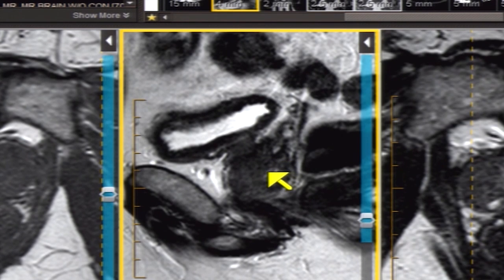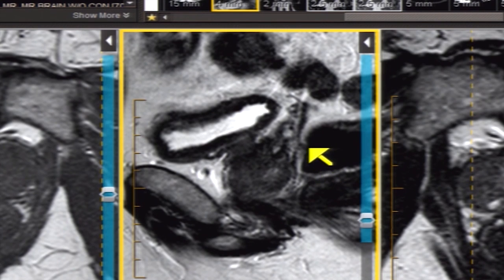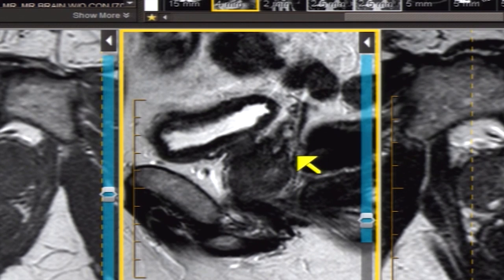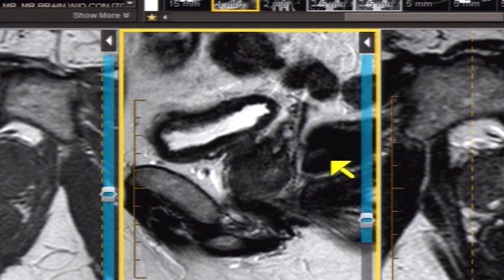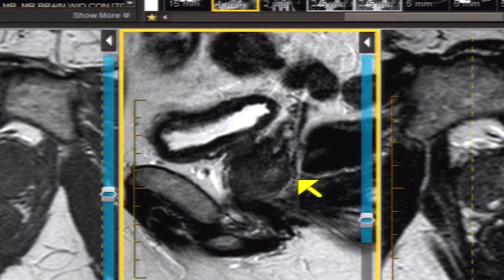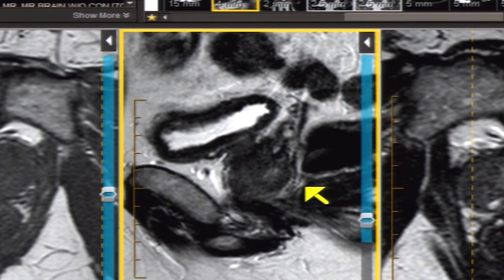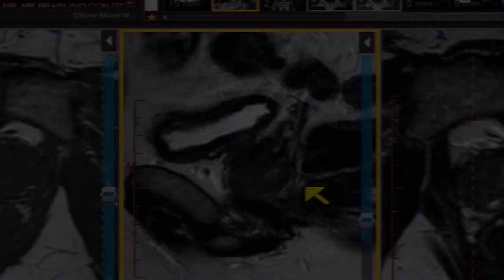On the opposite side, the peripheral zone is completely obfuscated, infiltrated, and replaced by solid tumor. In the front we have the fatty space of Retzius; behind we have a linear hypointense signal representing the Denonvillier's fascia and capsule, which separates the prostate from the adjacent rectum with a small amount of rectoprostatic fat. That concludes our introduction to prostate anatomy as seen by MRI in the coronal, sagittal, and axial projections.